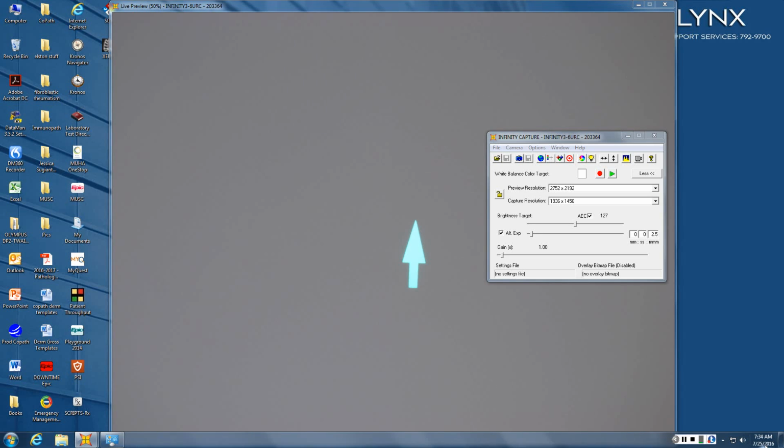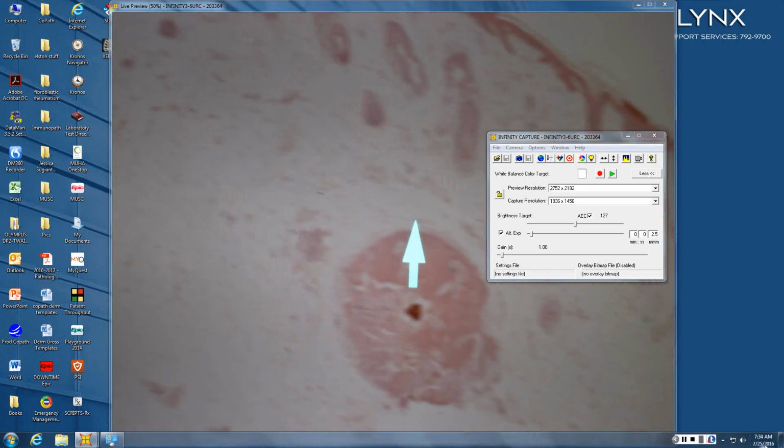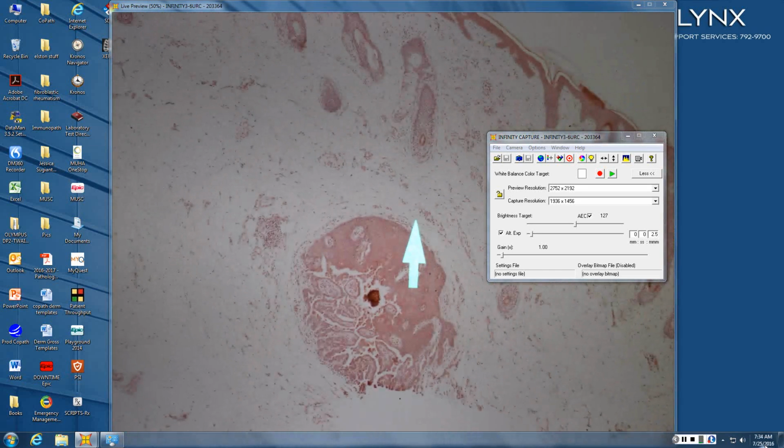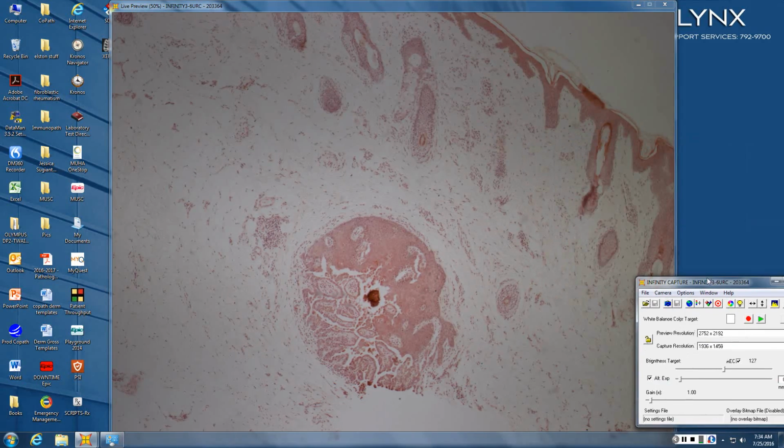So, okay. Let's make sure everybody is in focus. So, first off, we've got to make sure the monitor is in focus. Can you move that camera setting window over? Because the recording will be done. Absolutely. And we gotta make sure.